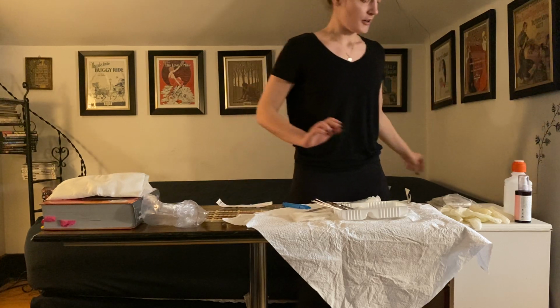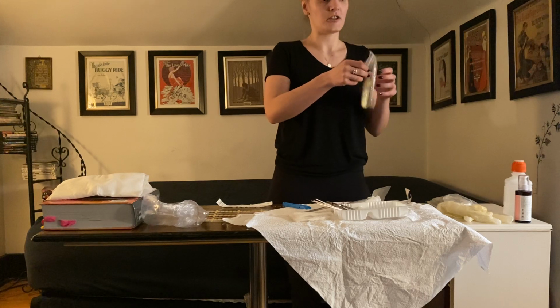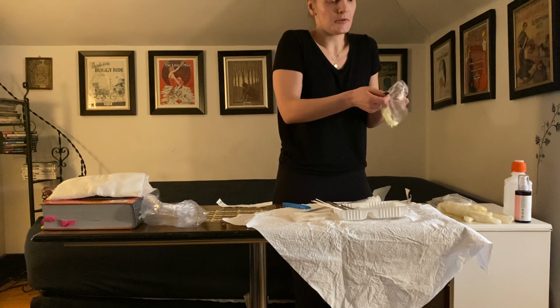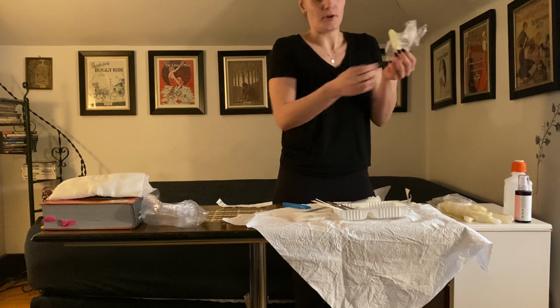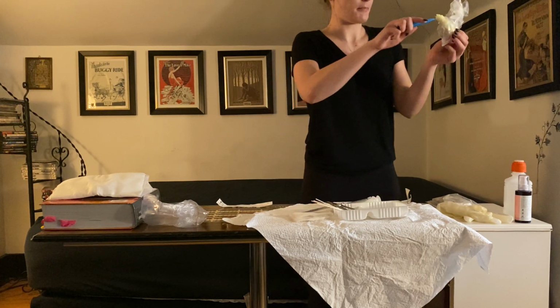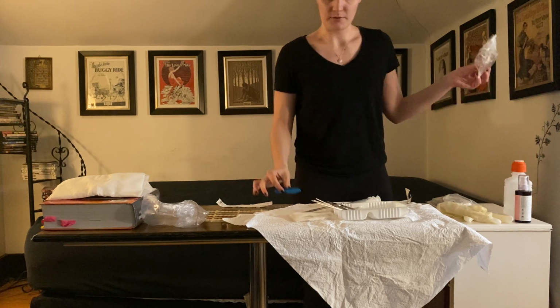Okay, and then I'm going to add my Curlex. So normally this would be in sterile packaging, and it wouldn't be pre-cut. This is pre-cut just because they had to cut it a billion times, but normally it would be a bigger roll and in sterile packaging. So just winging that back, and then adding that to the tray.